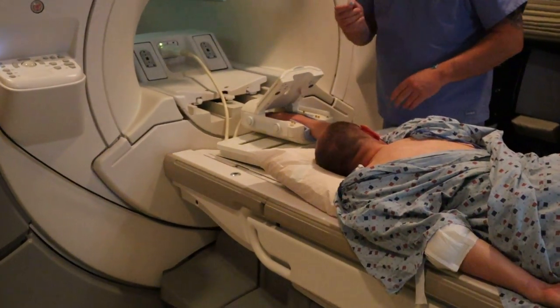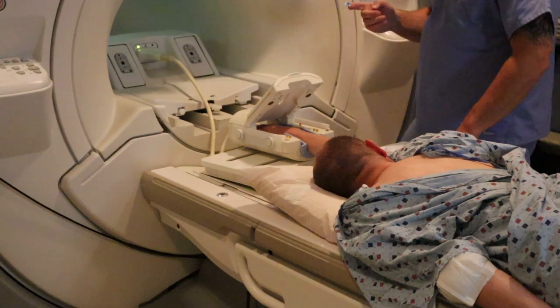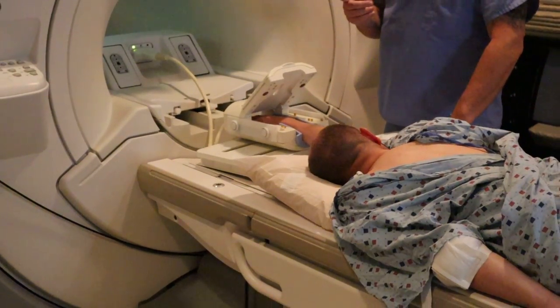This position is not easy, so we only recommend this on folks that can handle it, but it does offer better signal.